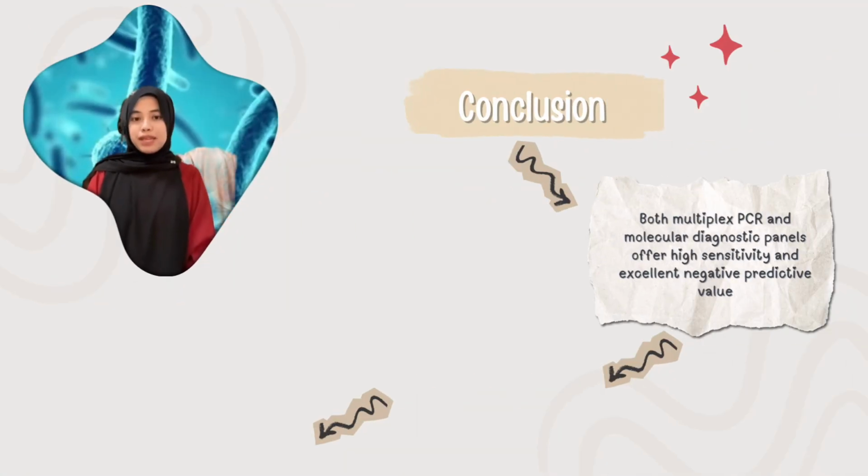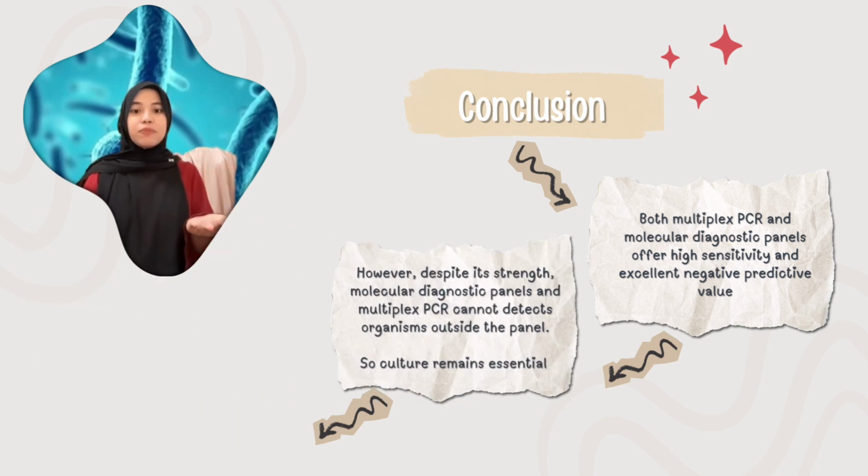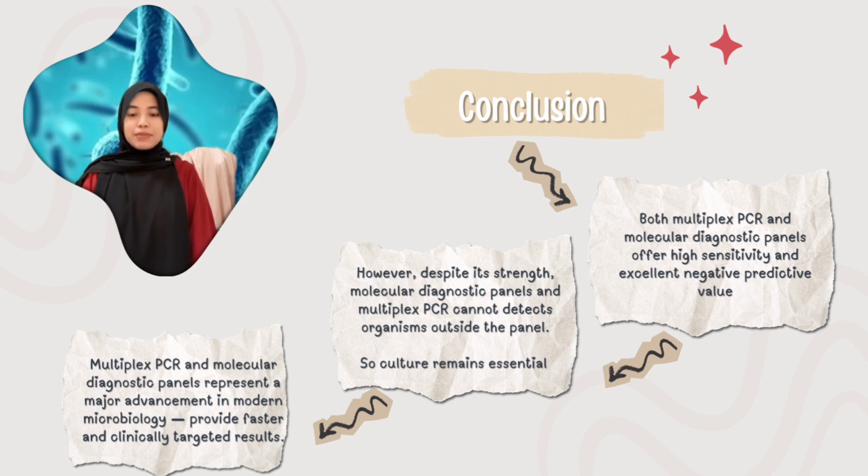In conclusion, multiplex PCR and molecular diagnostic panels offer high sensitivity and excellent negative predictive value. However, despite its strength, multiplex PCR cannot detect organisms outside the panel, so culture remains essential. Overall, multiplex PCR and molecular diagnostic panels represent a major advancement in modern microbiology, providing faster and clinically targeted results.